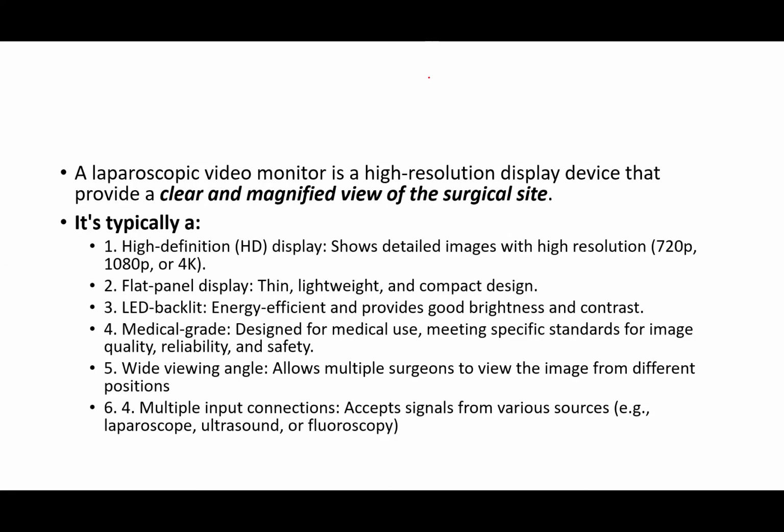Now, it should be nothing less than HD resolution. Even if you are using other devices that are not a laparoscopic video monitor, it should either be HD or 4K, a medical grade viewing device that cannot cause any harm by emitting some radiations, okay?